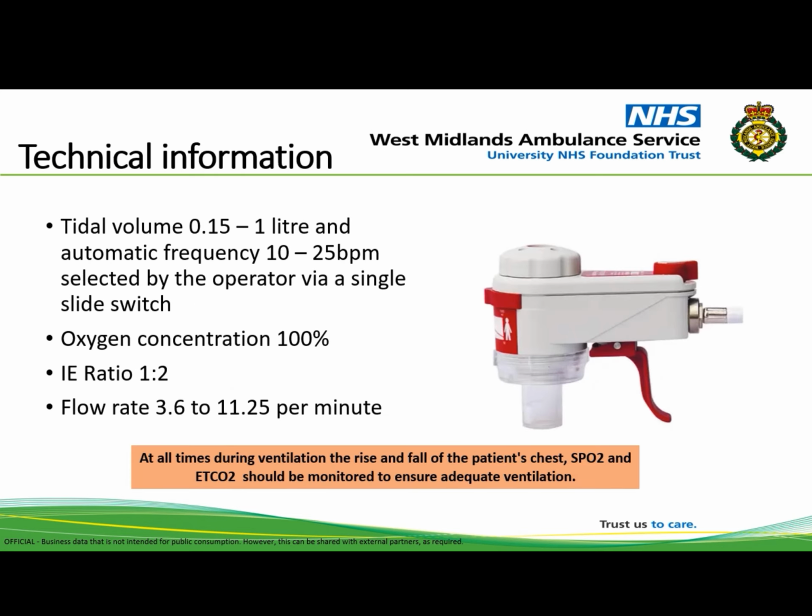The technical information regarding the MicroVent includes a tidal volume selection of between 0.15 to 1 litre and an automatic frequency of between 10 to 25 breaths per minute. This is selected by the operator using a single slide switch to alter both ventilation frequency and tidal volume. It has a continuous oxygen concentration of 100% with an inspiratory-expiratory ratio of 1 to 2.